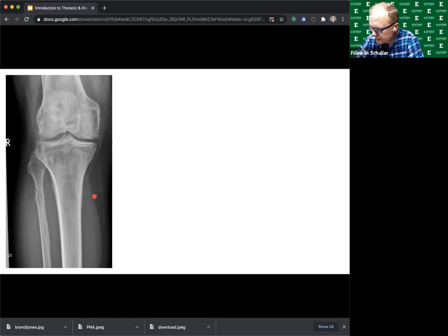Looking at the patella, the femur, the tibia, the fibula. Anything sticking out to you guys? A proximal fibula fracture. Beautiful. Yes, thank you, Tina. I would agree. Thank you, Julie. I see you too. Looks like there is a proximal fibula fracture, and this patient is going to need a knee immobilizer and follow up with ortho.